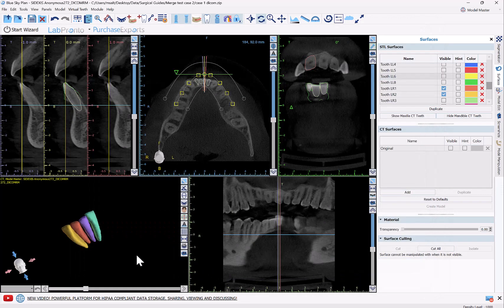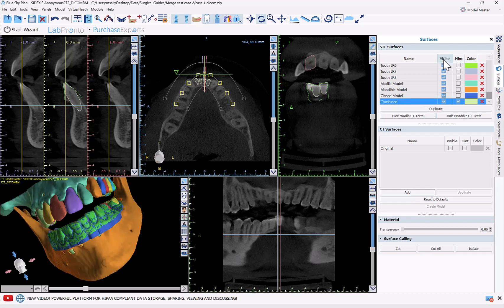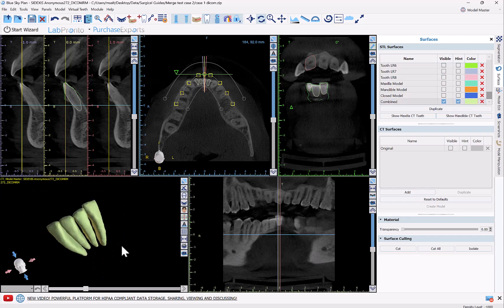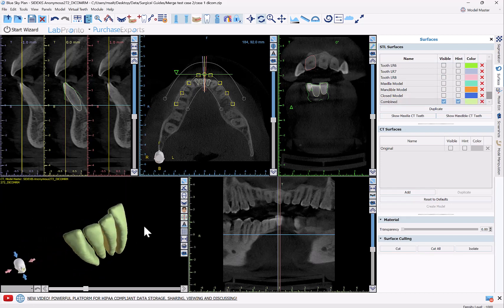This essentially mimics an export and then puts it right back into the software — that's why it's on the export screen. Now we can toggle off all of our surfaces and just show our new combined one. We can see we now have the four teeth here as one surface in Blue Sky Plan.